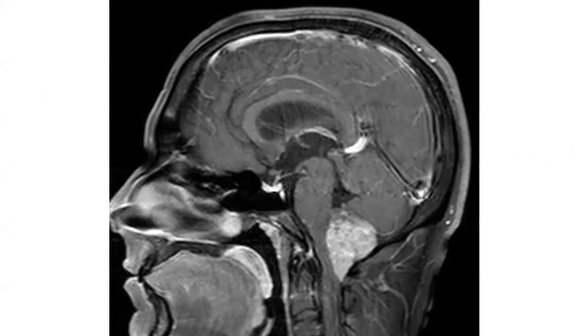There's a posterior fossa enhancing mass, kind of arising inferior to the foramen, and with this single image, I would include in the differential diagnosis an ependymoma and a subependymoma. Beautiful. Magnificent. Thank you. That was perfect.